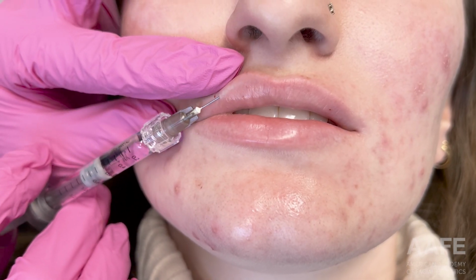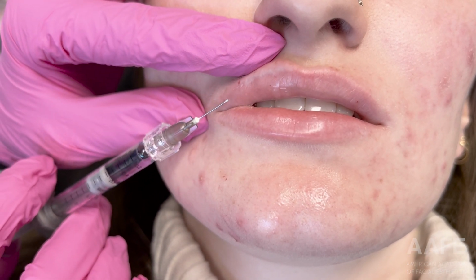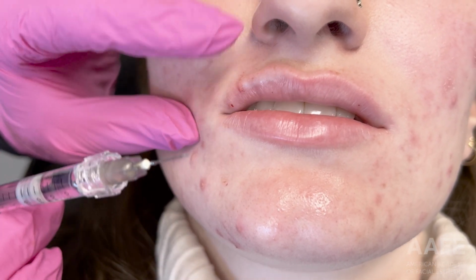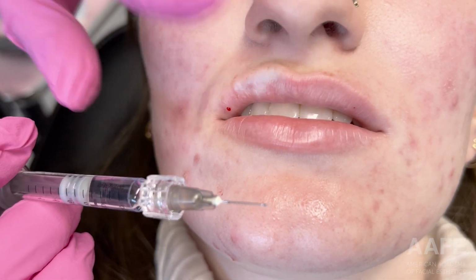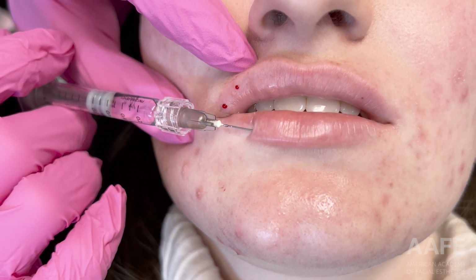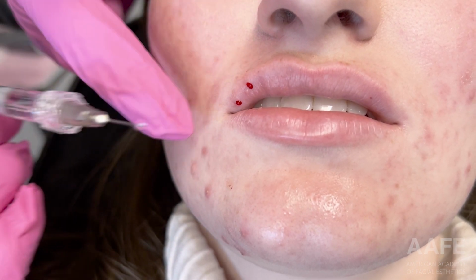Here we are showing her the lips, and she did love them, but she actually ended up requesting more. So we went ahead and placed a little bit more product. Here we're just talking about results and then going back in. You can see her lips are cleaned once again, and we're adding some slight volume to the lip, just because that is what she requested. Most patients who are first-time lip filler cases are shocked when they look in the mirror. They can look swollen and larger than they anticipate. In this case, she wanted more, which we love.